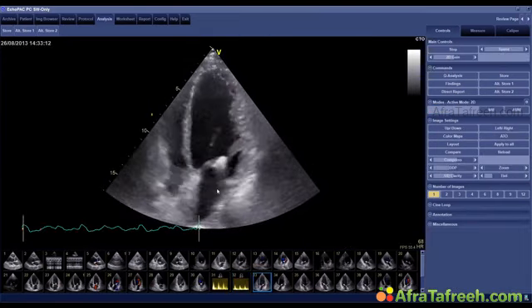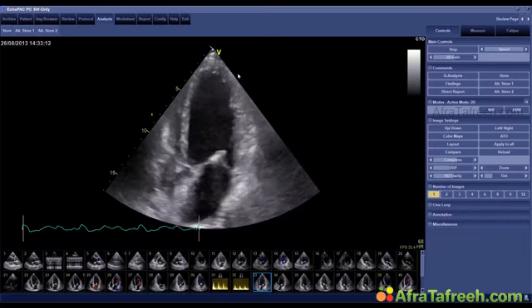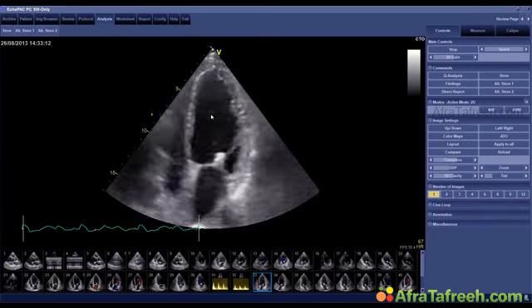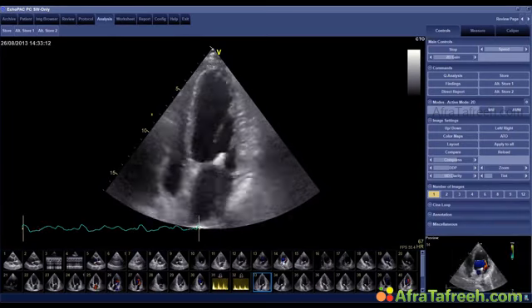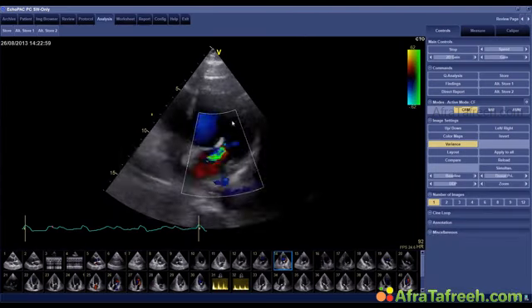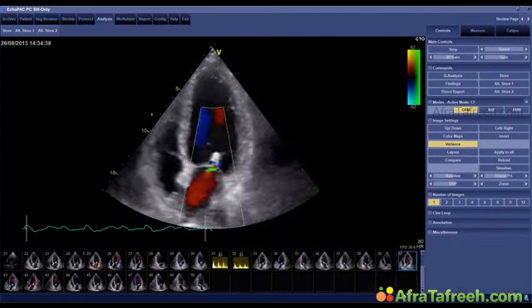But the second issue is that ventricular function now looks much worse. But don't be fooled. Even though ventricular function looks worse, the patient was doing clinically a lot better. Why? Because his regurgitation was less. Here is his regurgitation after the procedure. Okay, so I think we really helped this patient.